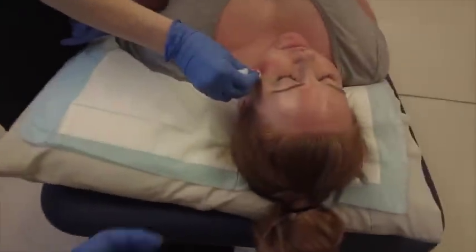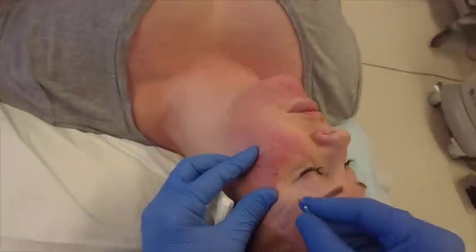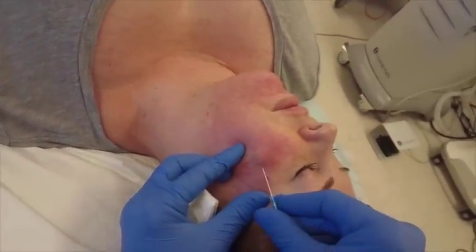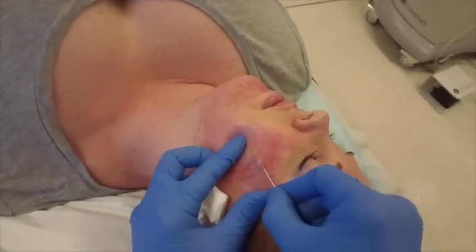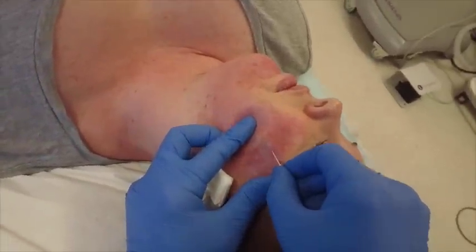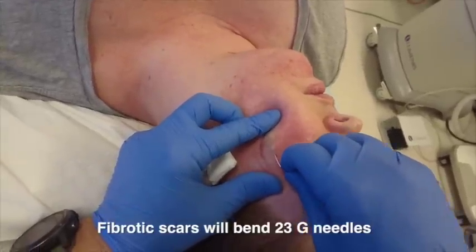Subcision nowadays can be used using various different techniques and various different needles. Subcision itself stands for subcutaneous incisionless surgery, and there are various different types.